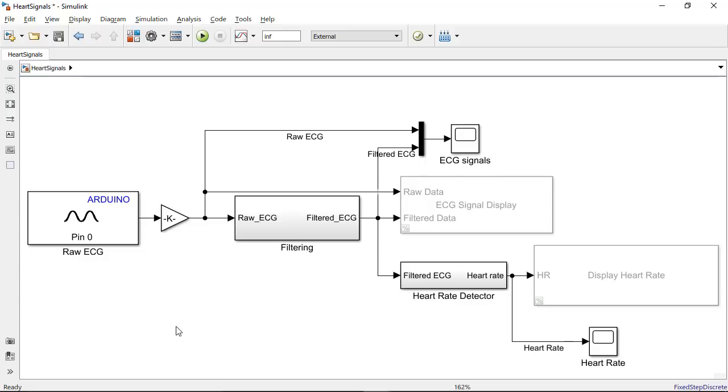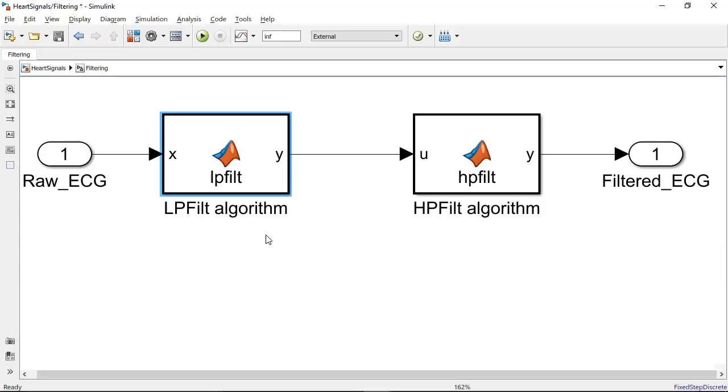As the next step, I brought in some existing MATLAB algorithms to do the filtering and to compute the heart rate by using these MATLAB function blocks. If you're interested in learning more about the algorithms that are being used here, search for QRS detector in the documentation.